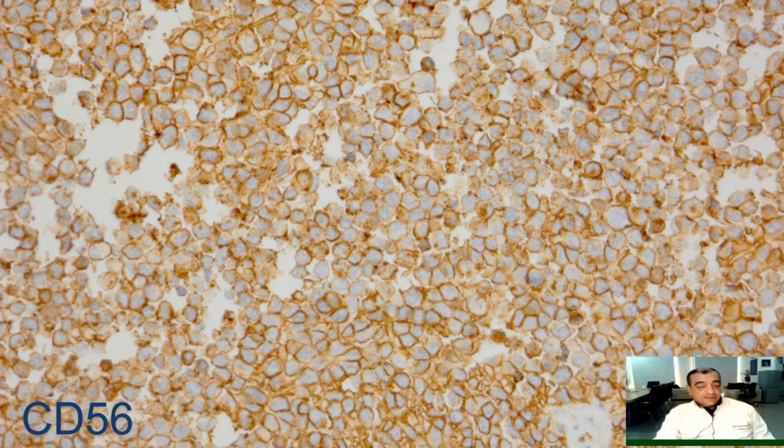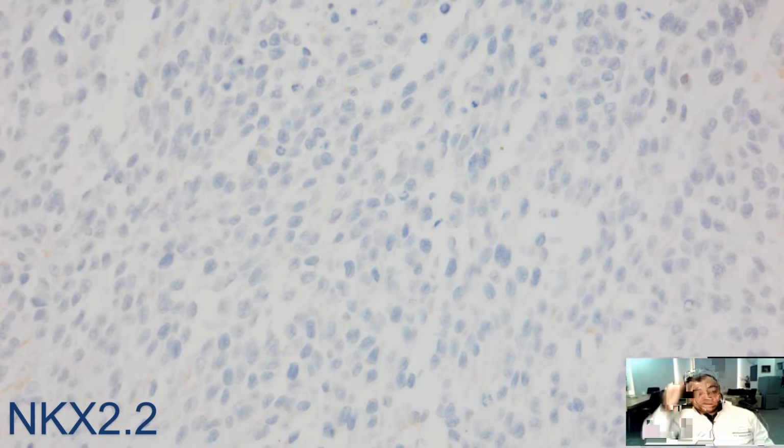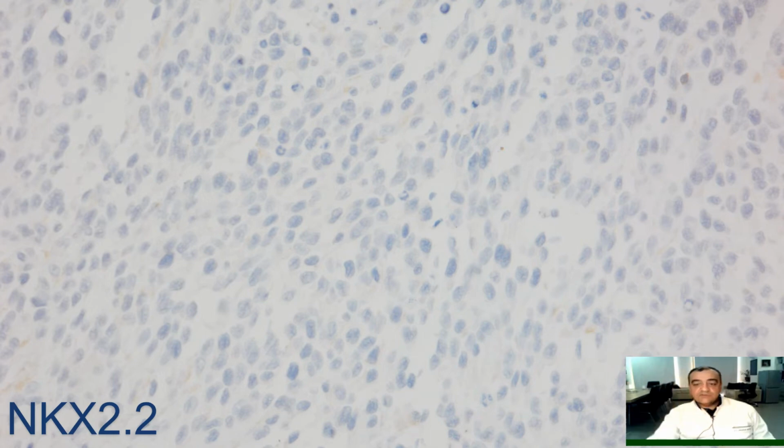So we go further and do our staining that we have already known, NKX2.2. We see that we do not have any positive nuclear staining with this antibody, so Ewing sarcoma can be excluded at this point.